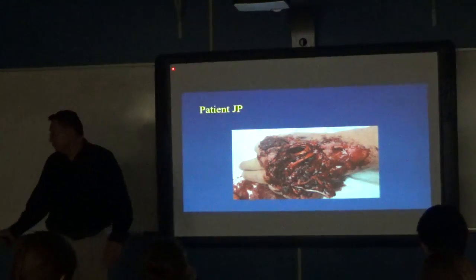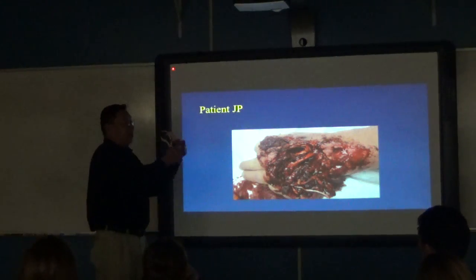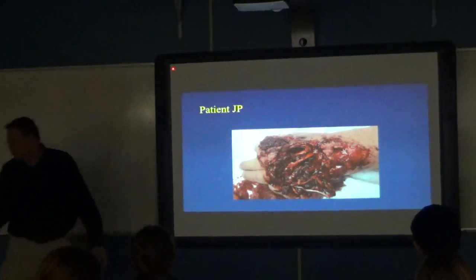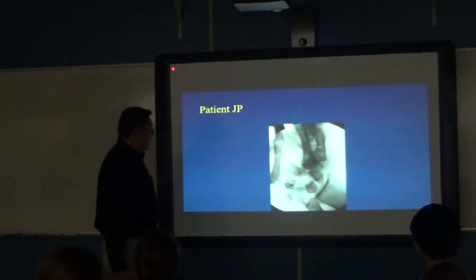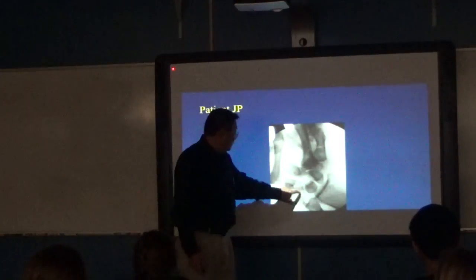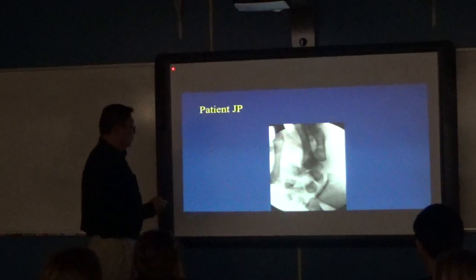I mean, you take this out, drop it there, you take this out, you drop it there, you take this out. I mean, it's not in the same spot. Yeah, ligaments are torn. Look at these x-rays. It doesn't look right, does it? Nope. Bones are everywhere. This is a good puzzle that night to fix.